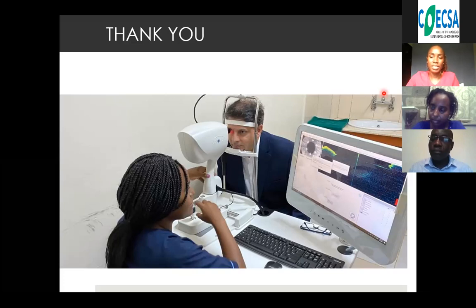If you put the age of the child to be 18, then at least you can compare their RNFL with an 18-year-old, which may not necessarily be accurate, but sometimes you really need to get that information to decide whether you treat this child for glaucoma or they have another pathology. So I don't have experience with the other machines, but if the OCT is indicated for a child, it should be done. If the child can concentrate and focus on that light, it should be done. But I know there's that limitation in terms of age with the OptoView.